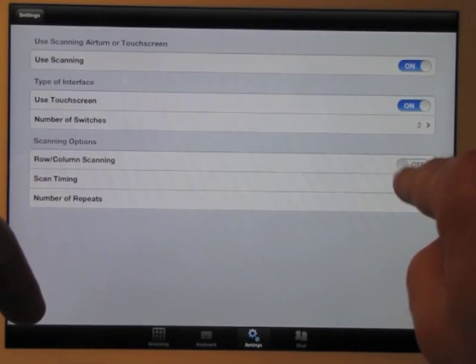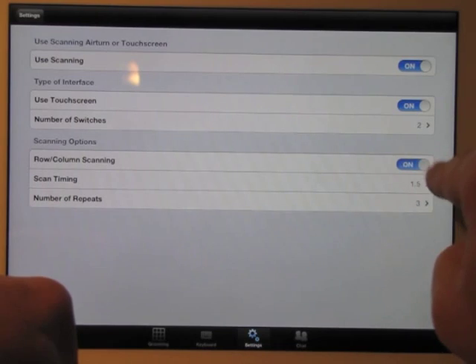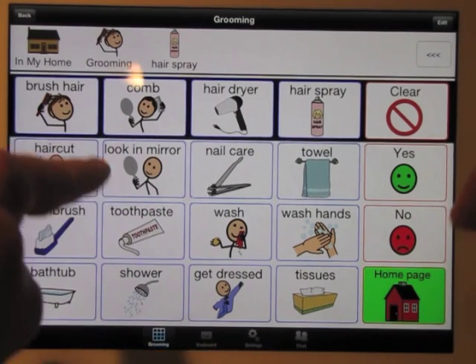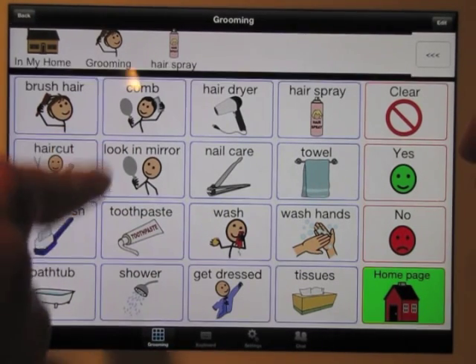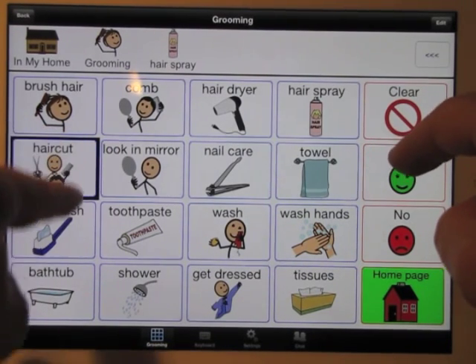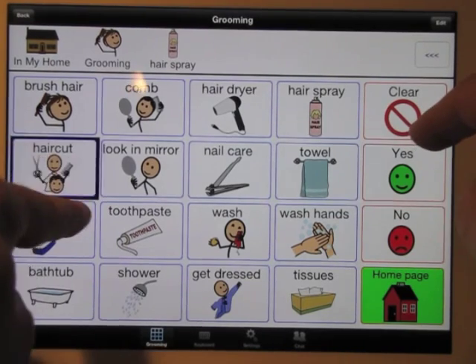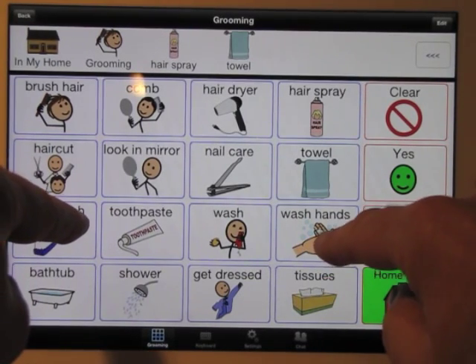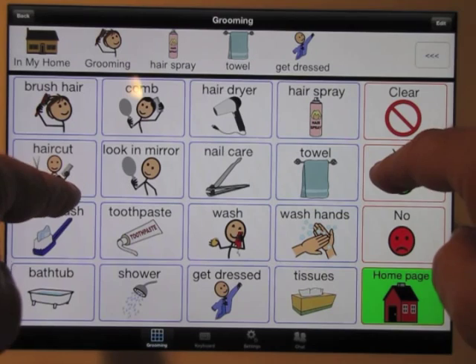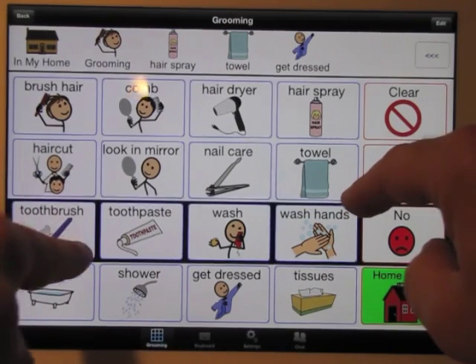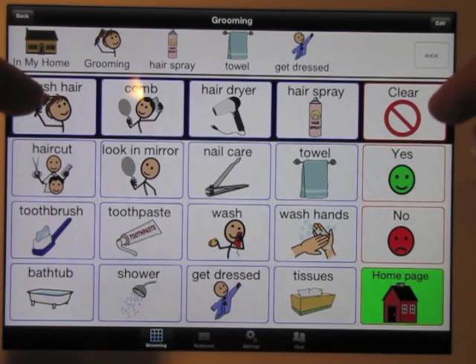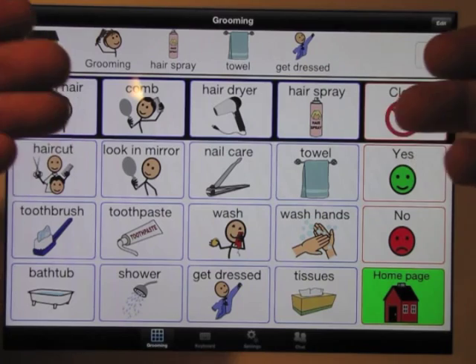Now let me put it on row column with two switches. Each time I hit the left side of the screen, it keeps going down — left side scan, right side select. So that's all there is to it. If I wanted to speak what's on the message bar: 'In my home,' 'Grooming,' 'Hairspray,' 'Towel,' 'Get dressed.' When you're using two switches, you're not using the automatic timer function — you manually move it from button to button by touching on the left side of the screen.